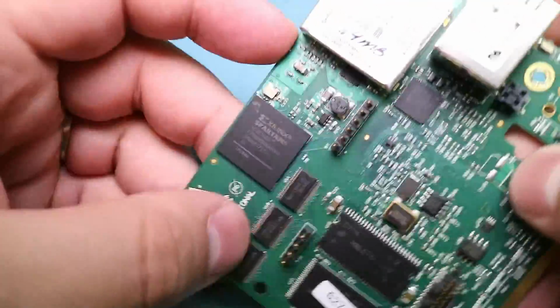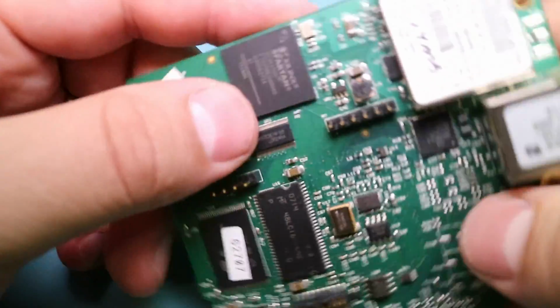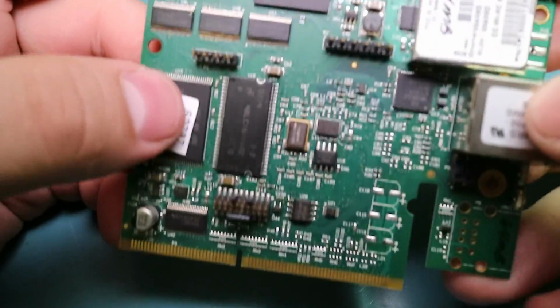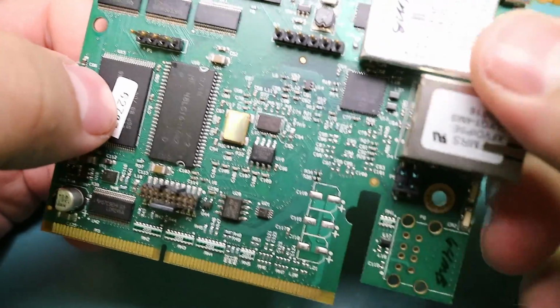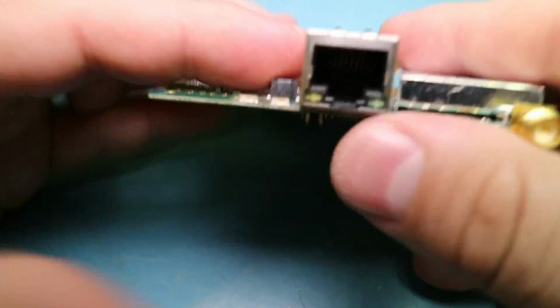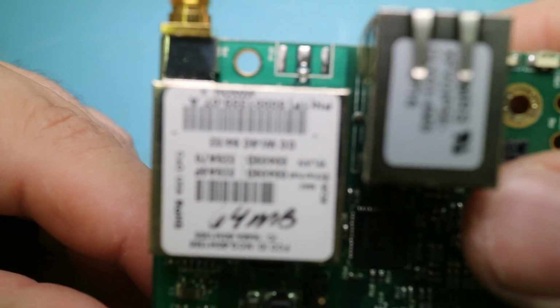You get this module and it comes with a small CPLD or FPGA, but I'm not positive where that's coming from. But they've got essentially an entire computer on this thing. It's missing some power supply stuff, probably for the second Ethernet port, which is not populated. This has 100BASE-T and 802.11b and g Wi-Fi.